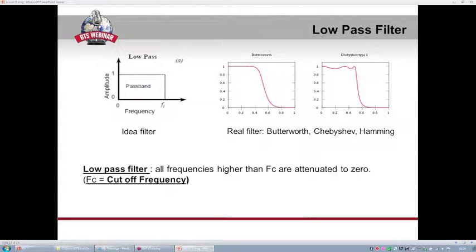They are very similar, but they differ just in the shape and in the degree of the slope, as you can see from this image. An ideal filter, in fact, has a squared shape, which allows to pass or stop exactly at the cutoff frequency, while a real filter does not have a square shape, but they have different shape and slope. So it doesn't matter now that you know the differences between the different algorithms, but just to know their meaning and how to use it.